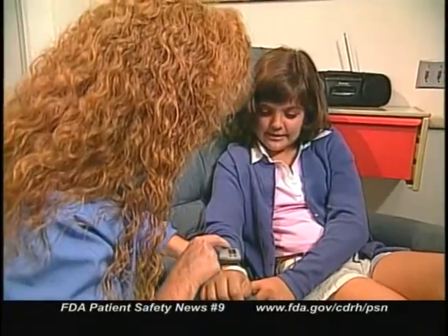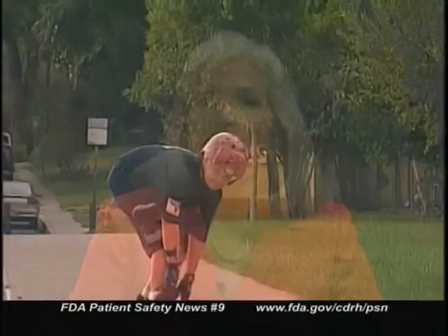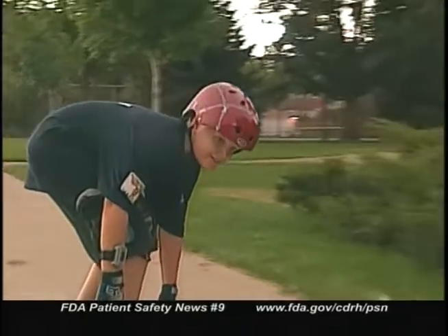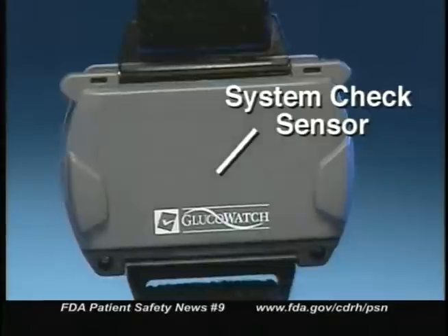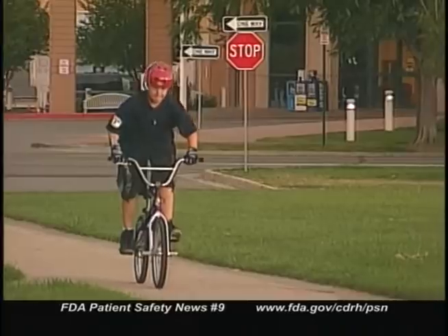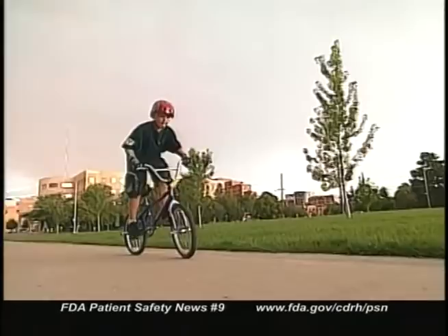It's called the GlucoWatch G2 Biographer and it's made by a California company named Cygnus. This device is different from the usual glucose monitor because it doesn't use blood drawn through a finger stick. Instead, a small electrical current from the device extracts a tiny amount of fluid through the skin. Then a sensor on the back of the watch measures the glucose level in this fluid every 10 minutes for up to 13 hours. These glucose measurements are stored in the device and can be read by the patient.